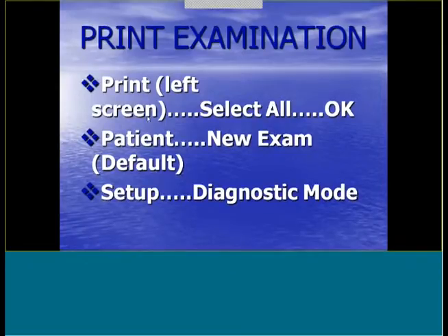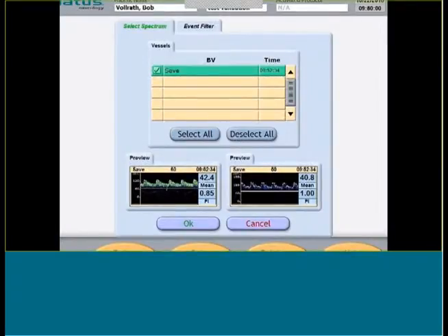Okay, so print is on the left-hand side of the screen. You select all, OK, and when you're done, you can go into your default again and set up for your diagnostics. So you want to go back in and set it up for diagnostic for when you're ready to come in in the morning. So you can see how here we have this saved, and it gives you a little preview here.